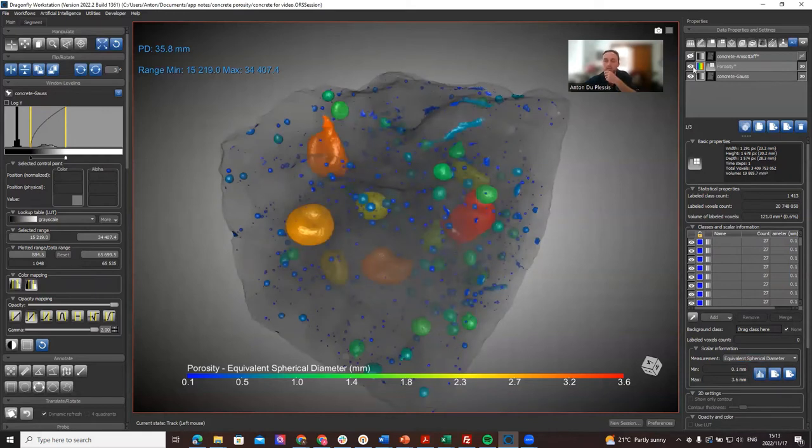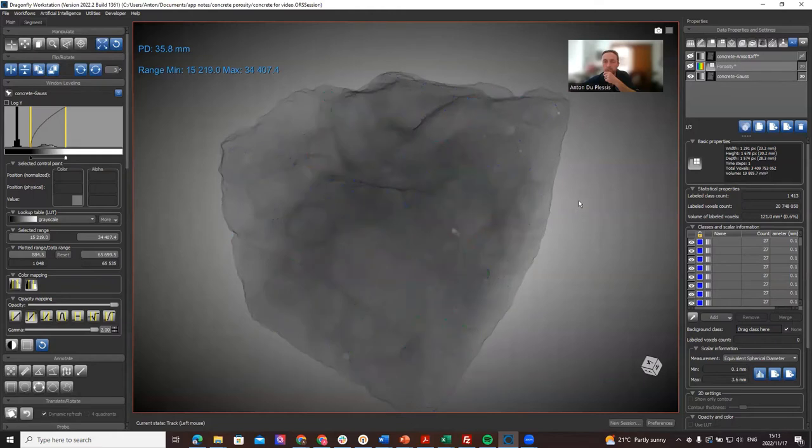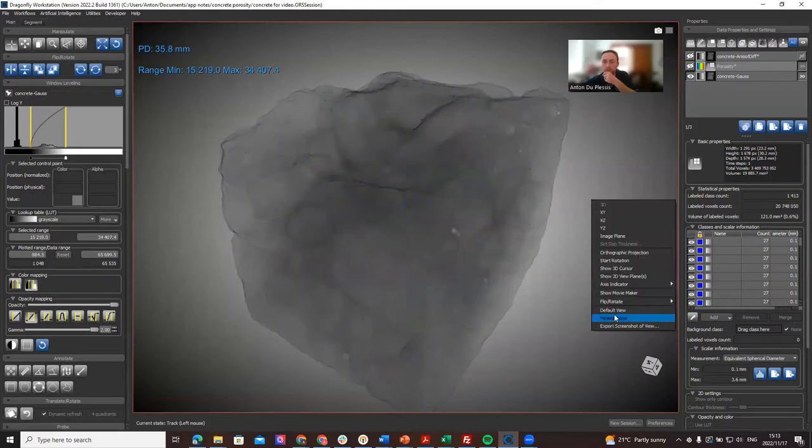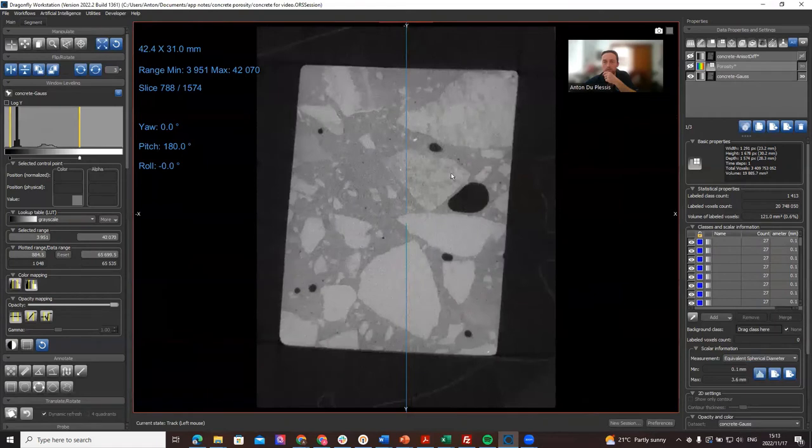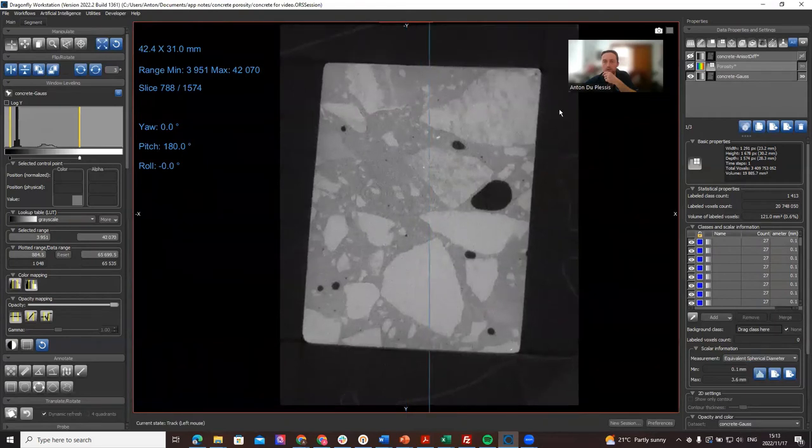The third thing I want to demonstrate, I can put the porosity analysis off and right-click and minimize view, is I want to show you image quality metrics. This is a new feature.